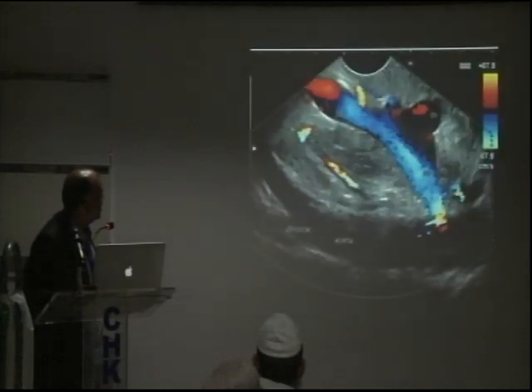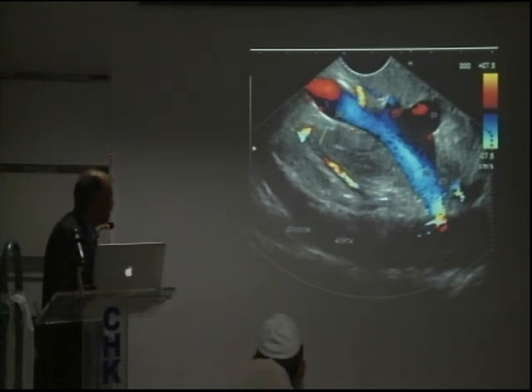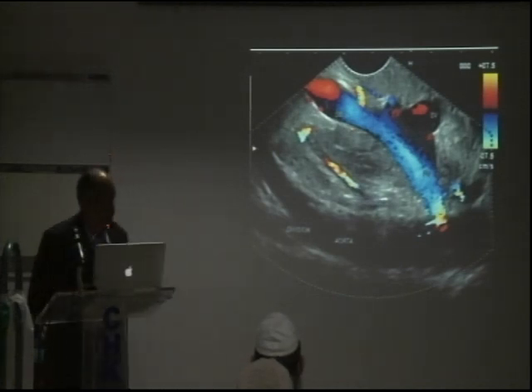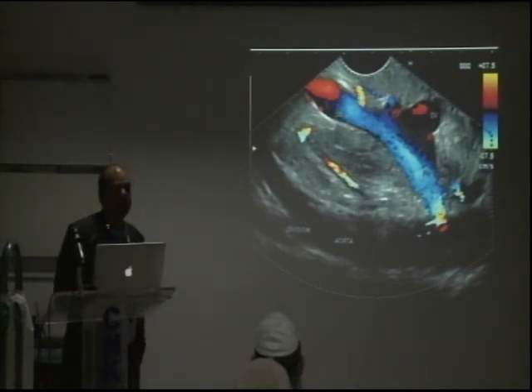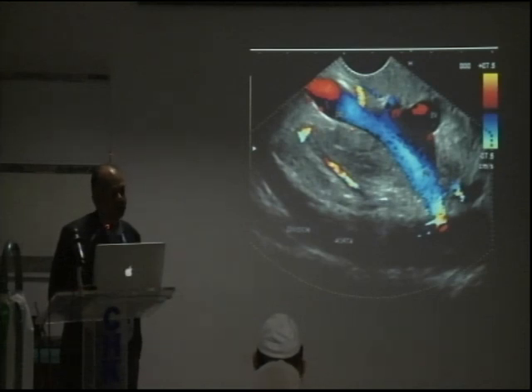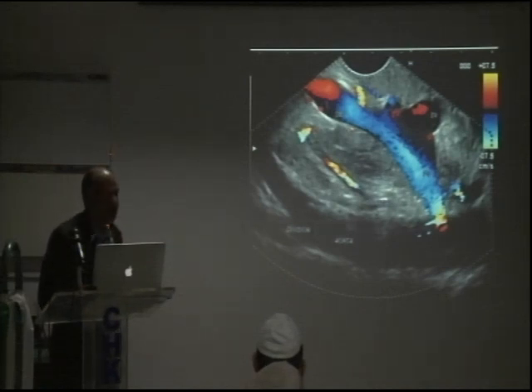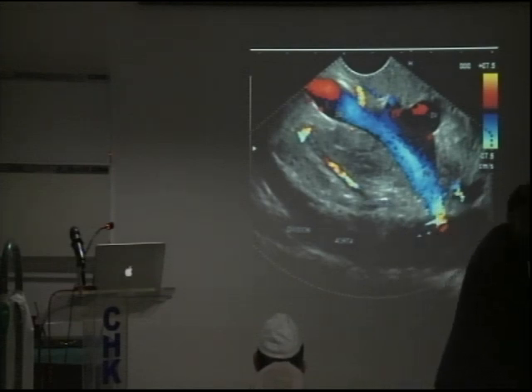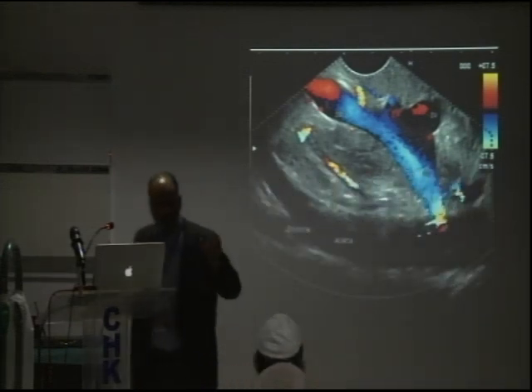Again, anybody? Where is the scope at the moment? If you have to say the station, which station is that? So just remember, where is the pointer? Very good.